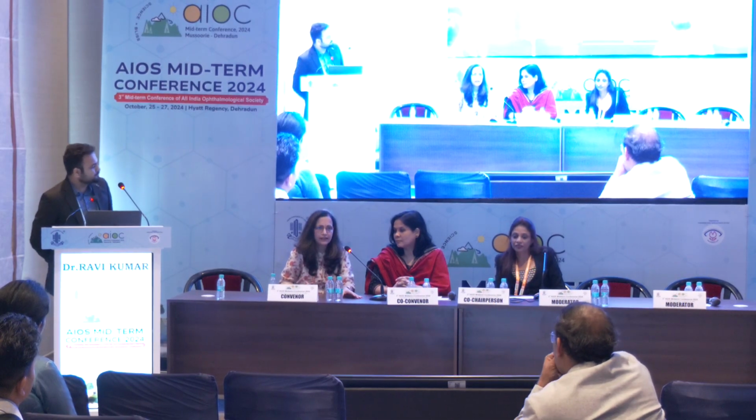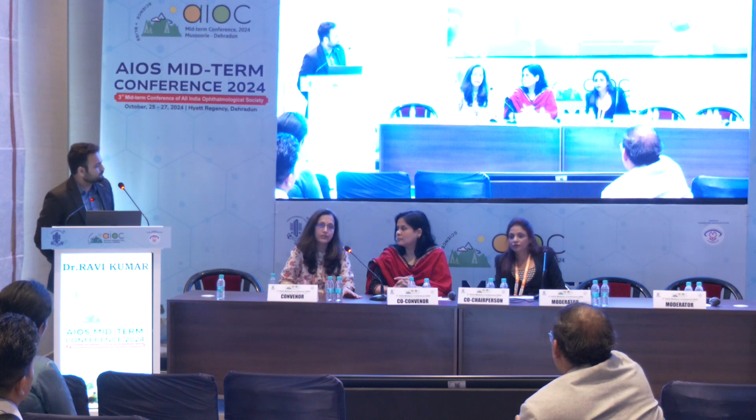Yes, for progression, it might be helpful, as you're rightly saying, but right now, till we have our own normative database, whether this person is going to be a suspect or is going to go from a suspect to a glaucoma is still the future. As we are advancing in technology, we are trying to detect earlier and earlier changes. So this is one of those processes where maybe these changes are starting much earlier and we are able to pick them up with these machines, but it is yet to be established with longitudinal data that ultimately these patients are converting to glaucoma.